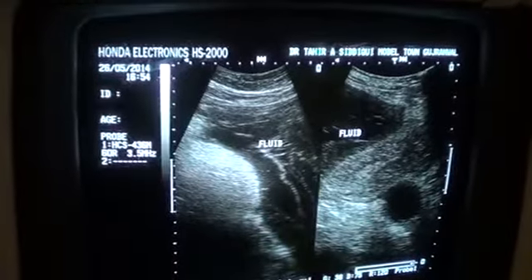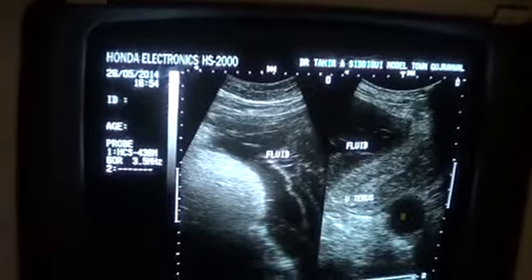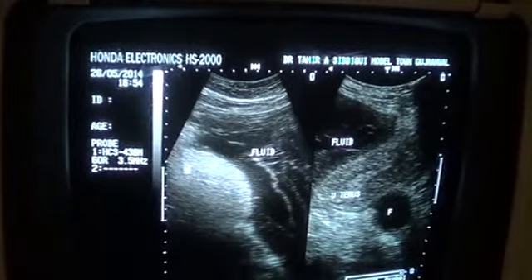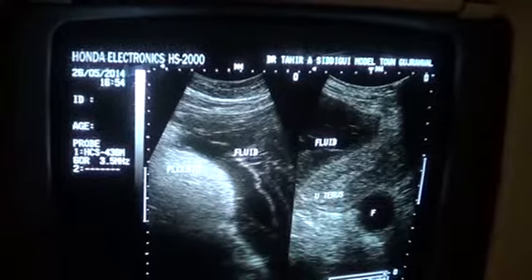So this is our case of the day. This is the uterus in longitudinal section. Remember, this is not a cyst. This is in fact the same fluid. This is fluid, and this is the placenta. So a case of retained placenta with associated complications. Thank you very much.